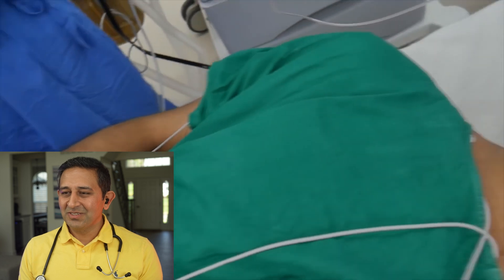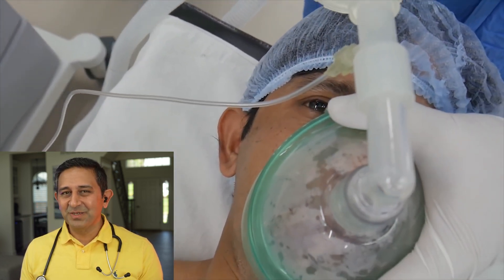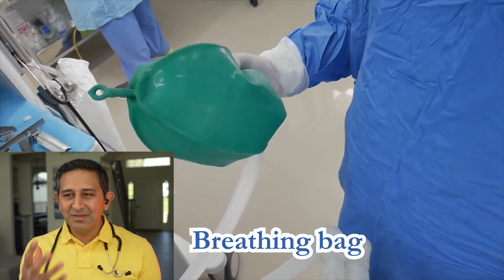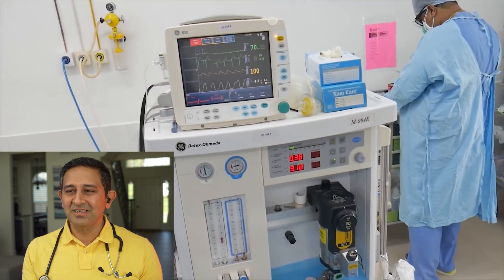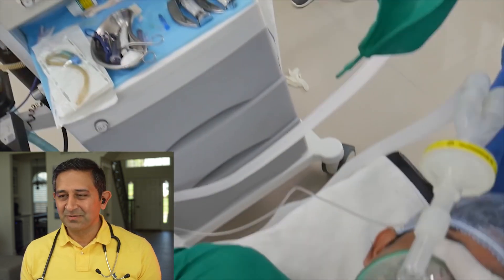As you can see, the eyes are trying to close and the patient is going to sleep. This is called the breathing bag that the doctor is squeezing — that is to give oxygen and maybe some anesthesia gas into the patient. Once the patient is off to sleep, they are not breathing anymore and the breathing is taken over by the anesthesia doctor.